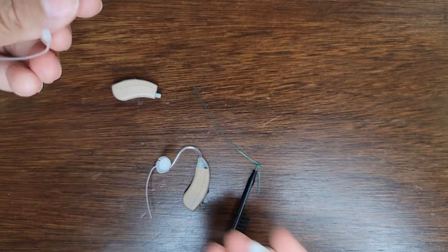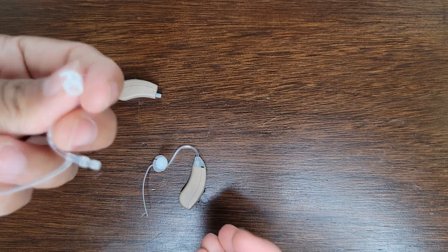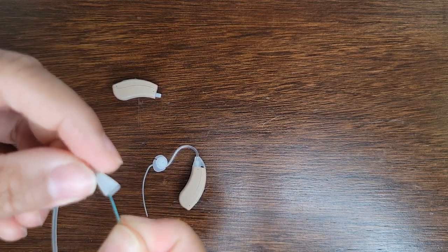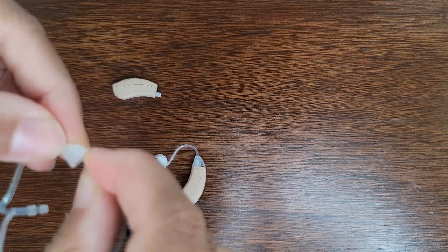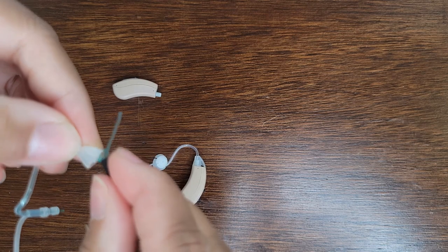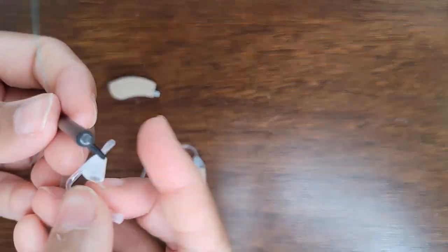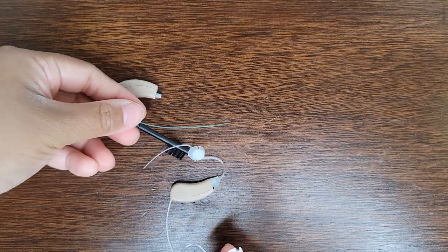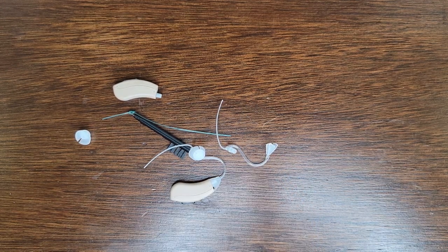So let's take off the dome. And we're going to try to clean the inside with this wire right here. So you can feed it all the way through, and you can use the brush side to wipe off any extra earwax that has built up. So that is how you would normally clean your device.